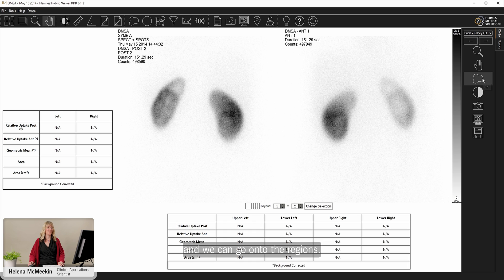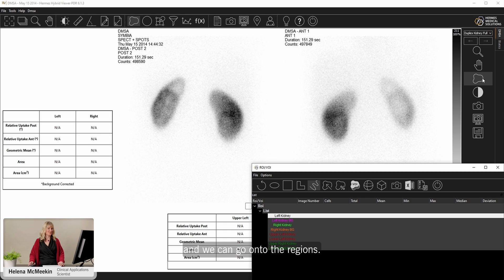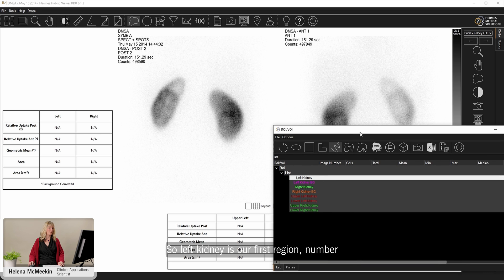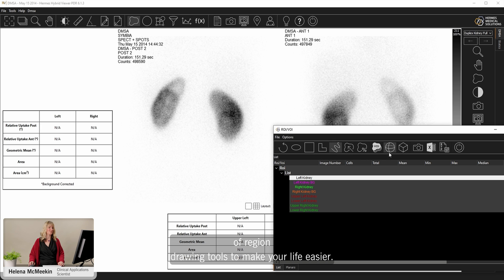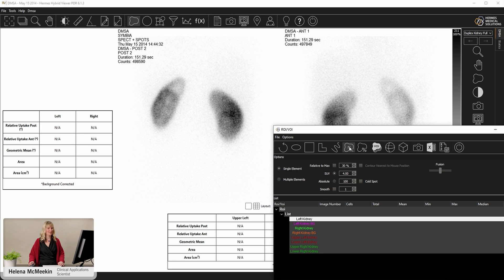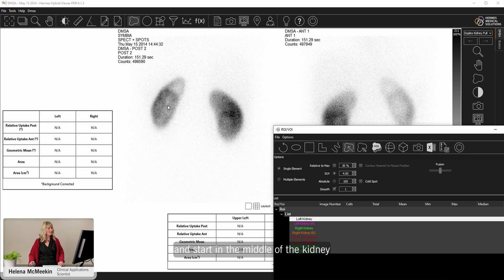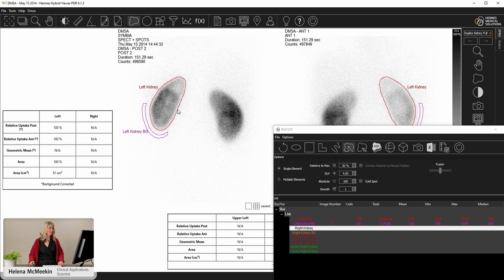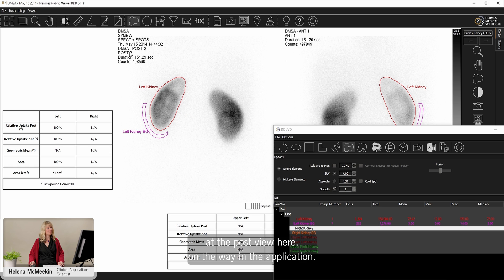Then we can go onto the regions. So we have our region list all here ready to go. Left kidney is our first region. A number of region drawing tools to make your life easier. Let's choose this seed tool. It starts in the middle of the kidney, and then just click and drag the edge to create the region.